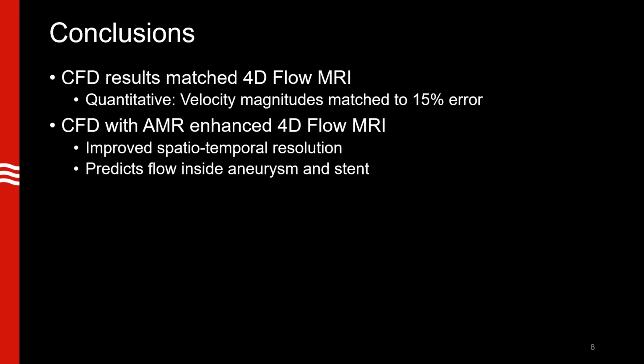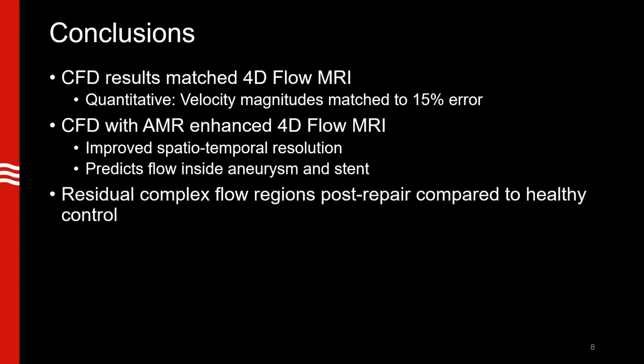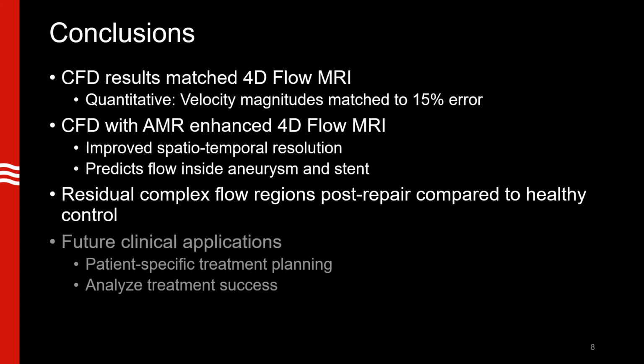Our enhanced technique also predicted the hemodynamics inside aneurysms and stents, which 4D flow MRI alone cannot image. Comparing the post-intervention cases with the healthy control showed that despite repair, there were still residual complexities in the blood flow. Future applications of our computational enhancement of 4D flow MRI are clinical. This technique can be used for patient-specific treatment planning as well as analyzing the success of intervention procedures. With that, I want to conclude my presentation.